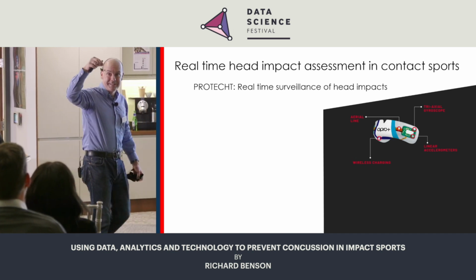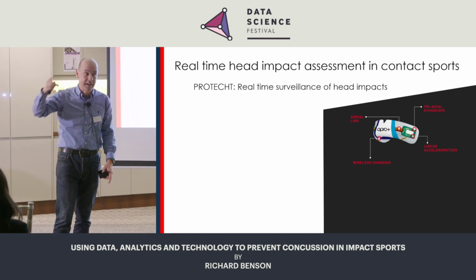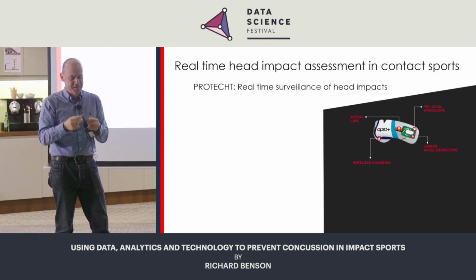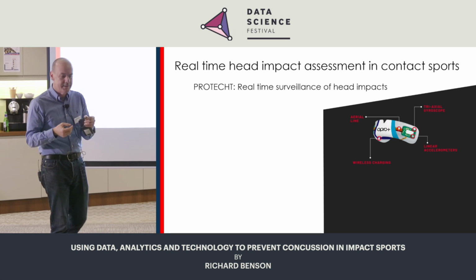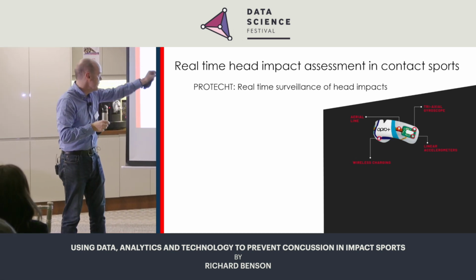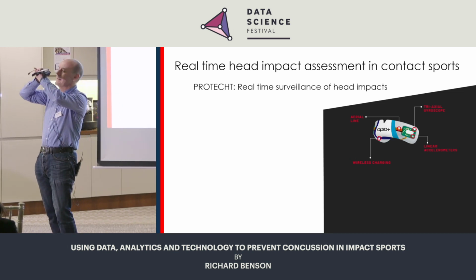And this is the bit. I spent 25 years designing silicon chips. I'm way more interested in this than that. So please pass this around. I'll just explain what you should look for, otherwise you'll just get a green thing in your hand. This little circular bit over here, that's the battery charger. Actually, some of it's labeled up there. This bit, if you're feeling really adventurous, you can hold it up to the light and see a little sinusoid.